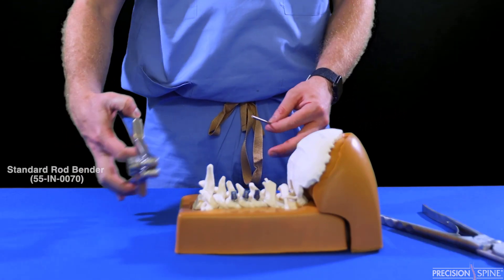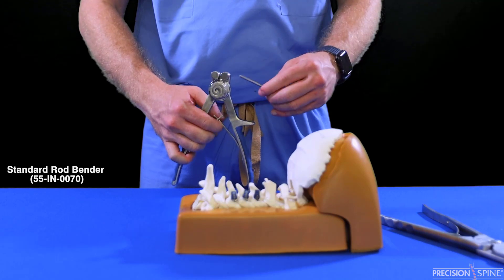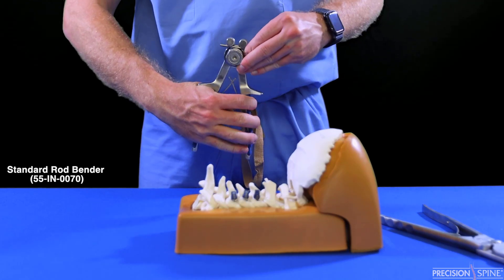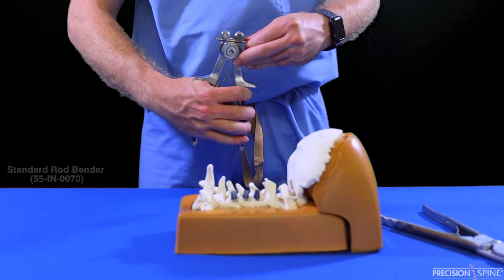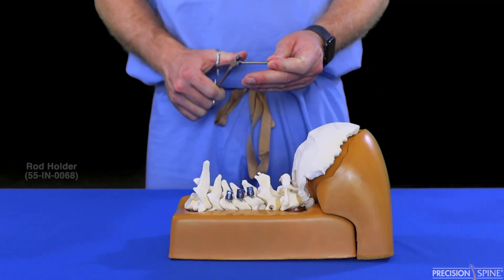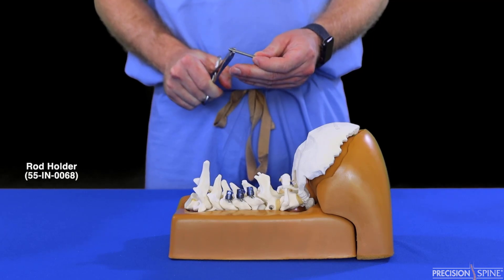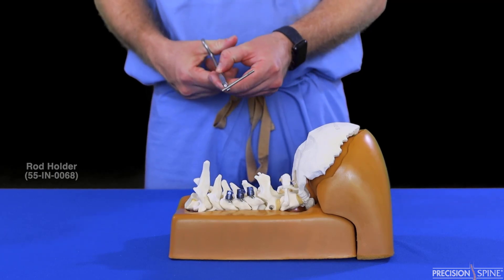If the rod needs to be bent, utilize the rod bender. Use the rod holder to then place the rod within the screw tulips.